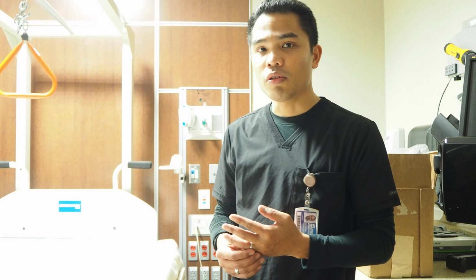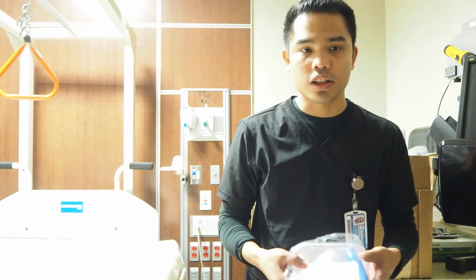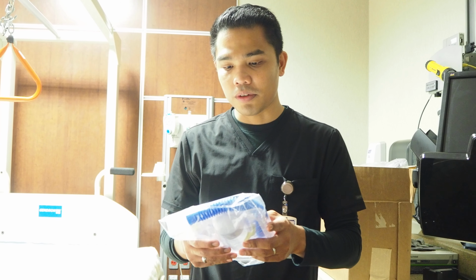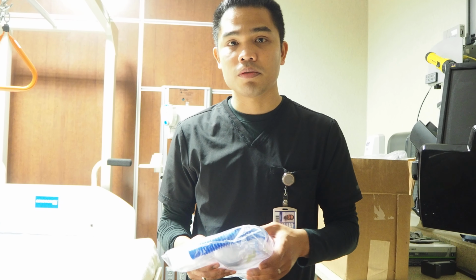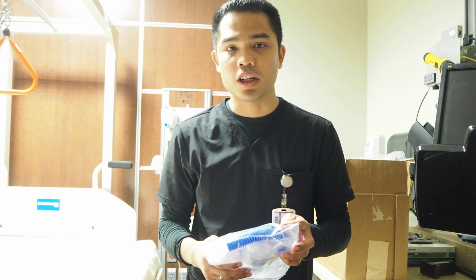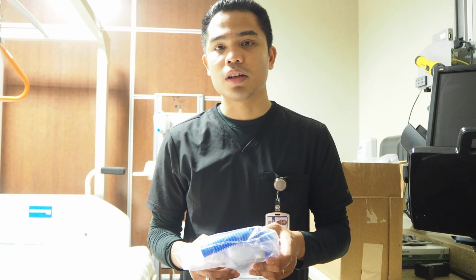the patient know what we are trying to do and explain to them thoroughly, such as this way: good morning, Mr. Anthony, and my name is Anthony also. I'm a respiratory care student from the respiratory department. So I have here an incentive spirometry, which is a therapy to help expand your lungs even more, and at the same time allow you to cough and also remove secretions, and this would help prevent your lungs from collapsing, especially since you just came from surgery.